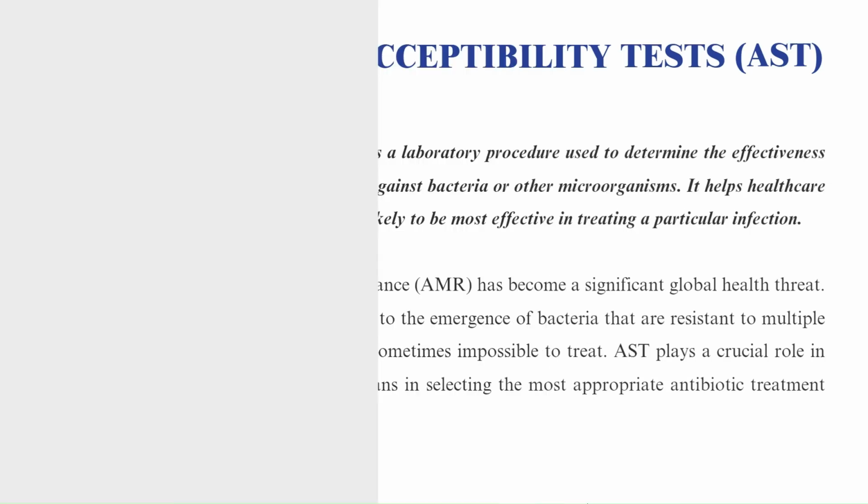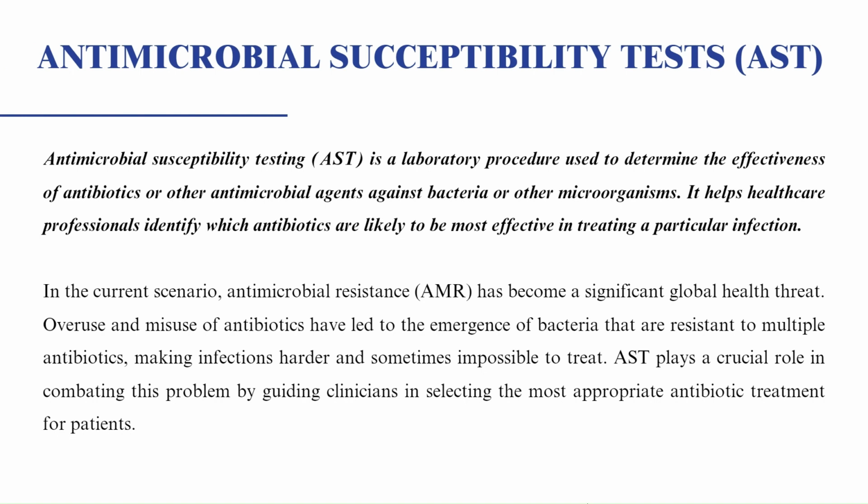Antimicrobial susceptibility testing is a laboratory procedure used to determine the effectiveness of antibiotics or other antimicrobial agents against bacteria or other microorganisms. It helps healthcare professionals identify which antibiotics are likely to be most effective in treating a particular infection. In the current scenario, antimicrobial resistance has become a significant global health threat. Overuse and misuse of antibiotics have led to the emergence of bacteria that are resistant to multiple antibiotics, making infections harder and sometimes impossible to treat.